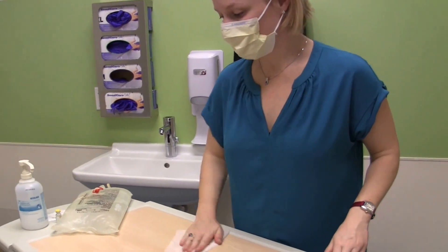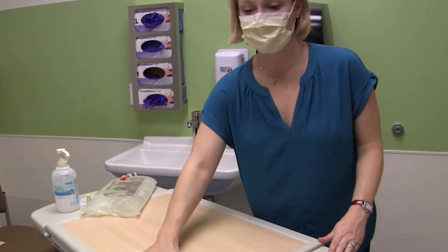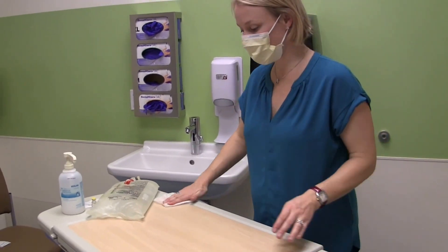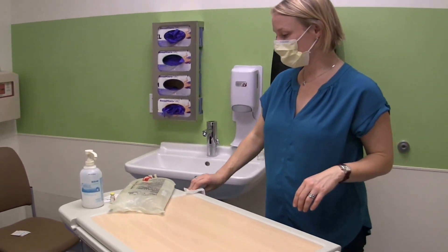While I'm cleaning the surface area here, we are going to add heparin to my bag of dialysate tonight because I have fibrin in my drain fluid. So I called my PD nurse and let her know.